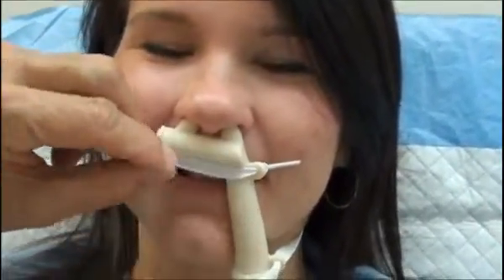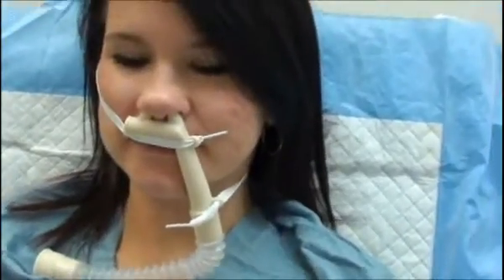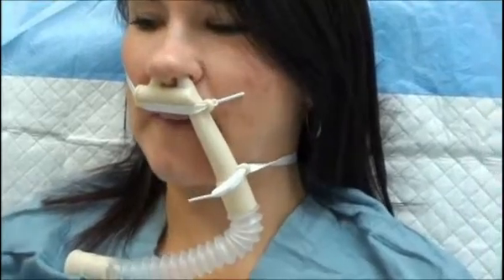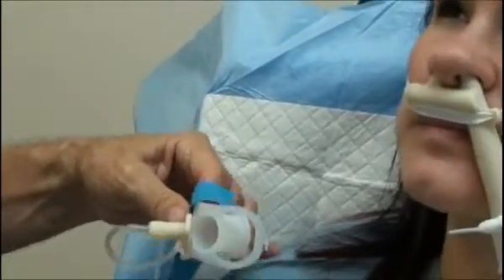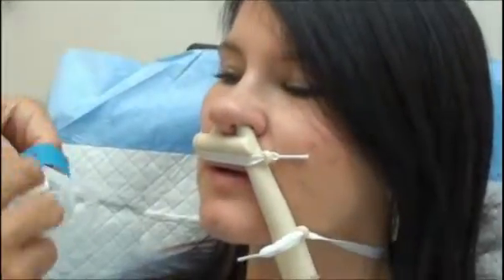Now let me show you something else. We take this bite block here. I put the hinge that we made earlier on the upside because when we're doing ERCPs, you tend to be lying on your left side. So I put the hinge on the upside and bring this around.